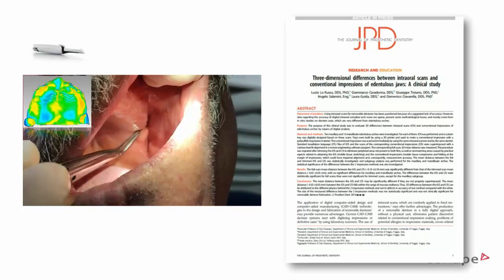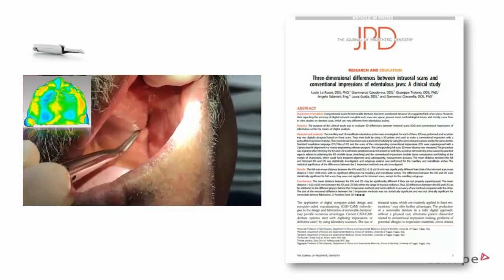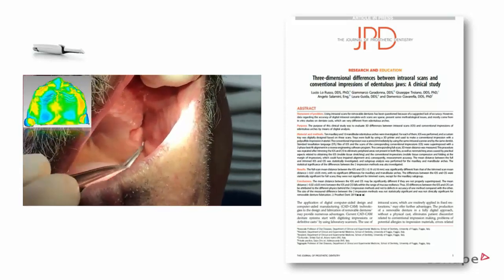I can also see there's a couple of questions here. Yeah, so one question was how the dentist scans the relation between upper and lower with his TRIOS when the patient is edentulous. So basically, does he scan the wax bite? How does he do this?